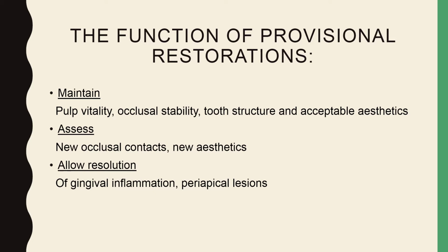By using a provisional restoration, we maintain the pulp vitality, occlusal stability, tooth structure, and acceptable aesthetics. And we can also use provisional restorations to assess new occlusal contacts and new aesthetics in case we are doing massive reorganized work. It also helps in allowing resolution of any active disease such as gingival inflammation or periapical lesions.